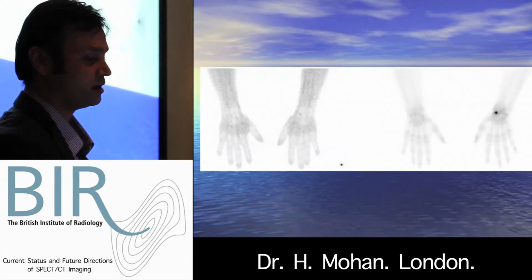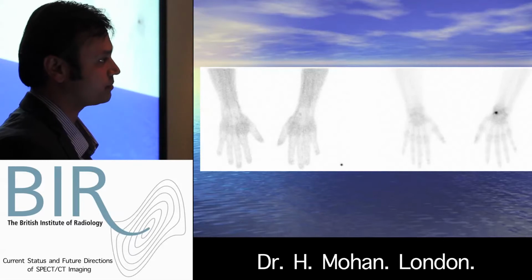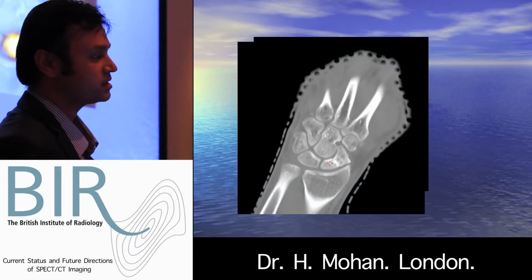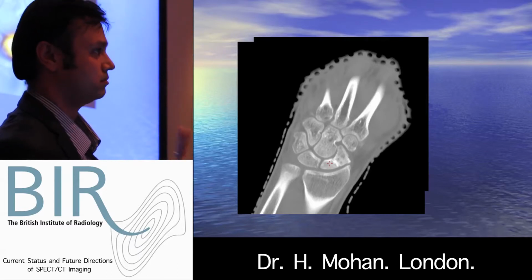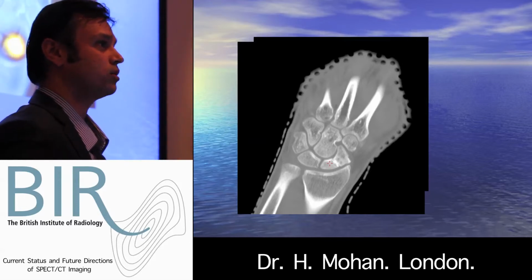Another patient had, again, pain in the left wrist with increased focal uptake on the delayed image and early vascular increase. You can see that this patient had a diagnosis of scaphoid fracture done long before, so there's continuing pain. So the question was, has the scaphoid fracture united or not?